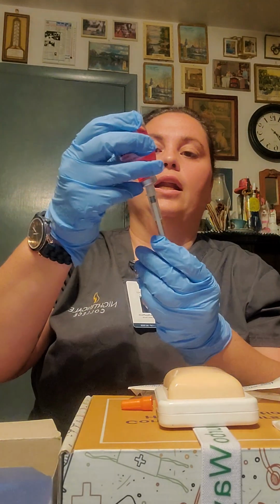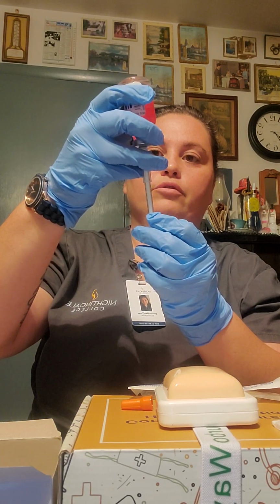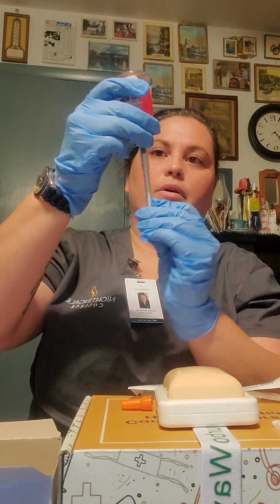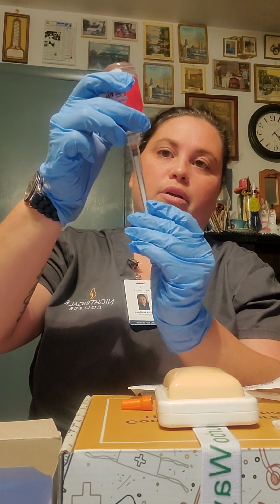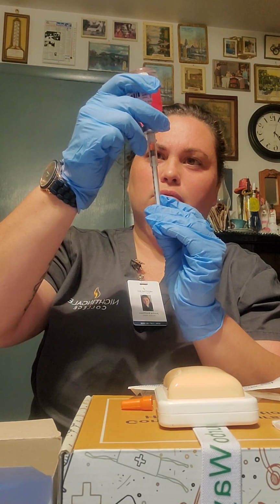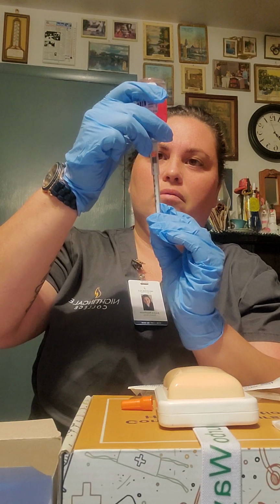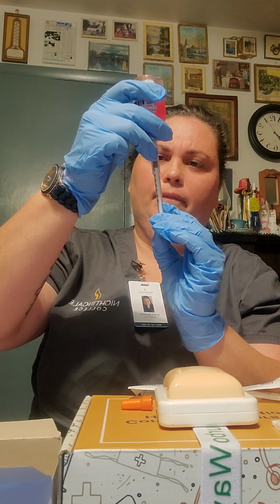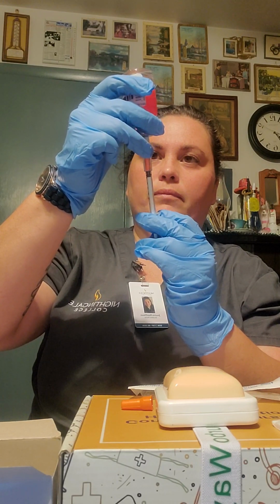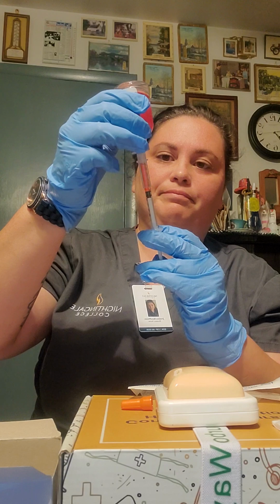Going to flip it over. I'm going to slowly withdraw. I would push back up on the plunger if there were any air bubbles. Alright, I'm pulling back to 1 ml, keeping my needle in my solution.